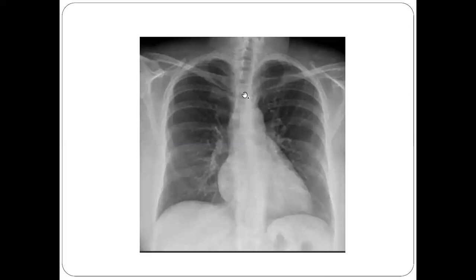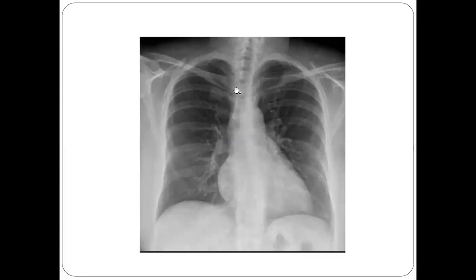Here you can see another x-ray where the spinous process is visible, and the distance between the spinous process and the medial end of the clavicle is less on the right side compared to the left. This lesser distance on one side indicates the patient has rotated toward the right, or the x-ray is rotated to the right.